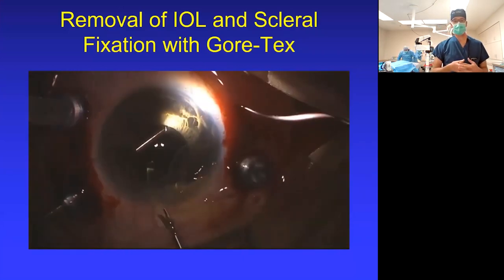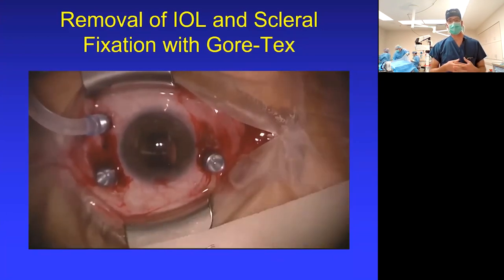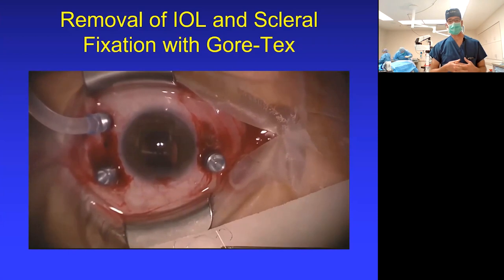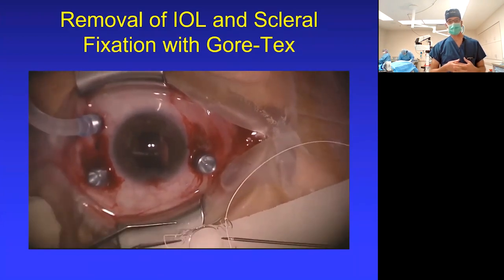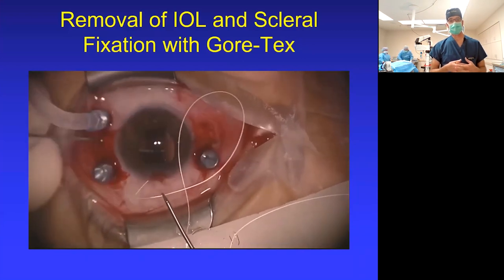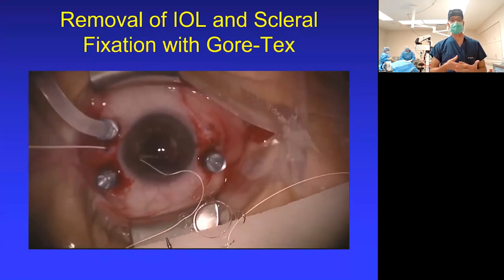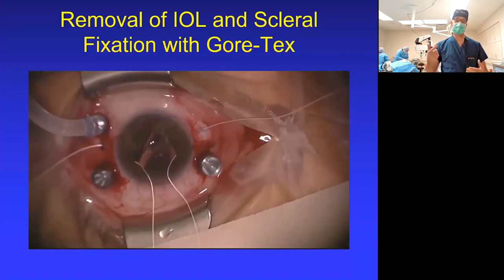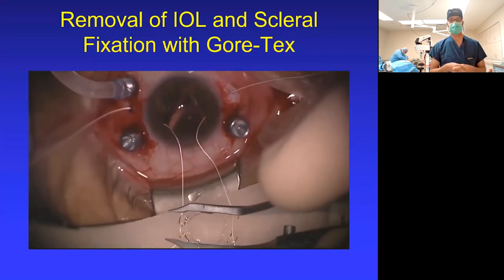They're getting it ready. That comes out. There's the Acrysof. This is obviously a very edited surgical video, so things look very simple and quick, but you'll see in the surgery, this is a much more nuanced procedure. It's a handshake technique to pass the suture off from one to the other, grasp it, externalize the suture. We're going to fold the lens.